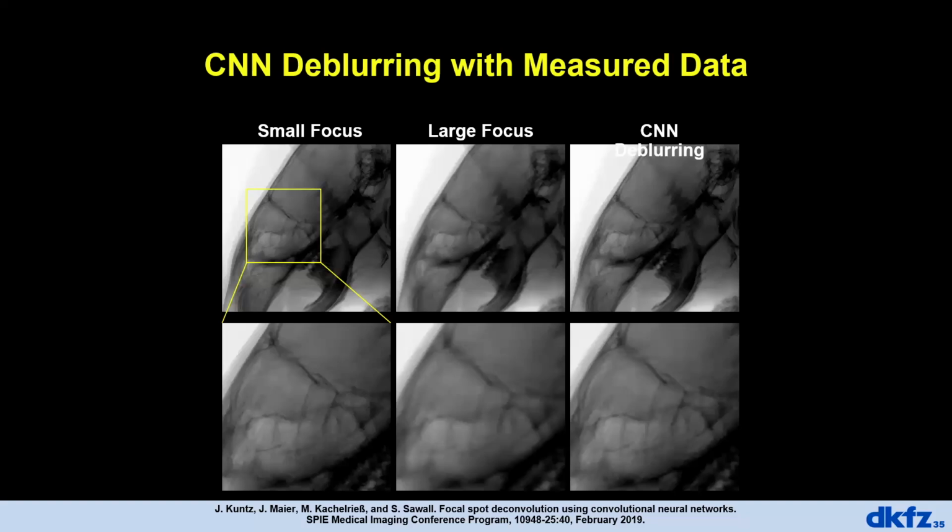And this also brings us back to the question of Niklas, because they are good at coming up with new information that might seem reasonable, but this information might change the anatomy if you reconstruct those data. And that's why we need methods to also quantify anatomical correctness. It's not enough to just say, okay, we have a low SSIM or a small root mean squared error or something like that, because that image might still show artificial structures.